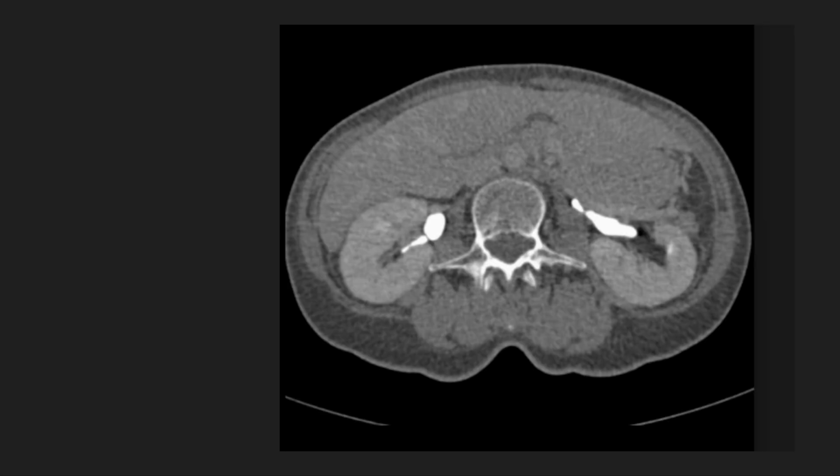And then we come to the last CT scan. Which phase is this? You can notice here that there's contrast going through the ureter and eventually down to the urinary bladder. So this is known as the renal excretory phase. This renal excretory phase is important to assess: is the contrast being excreted? Is the kidney functioning well? Or is there a renal mass or obstruction in the way of the kidney? So the renal excretory phase is also important for a lot of things.